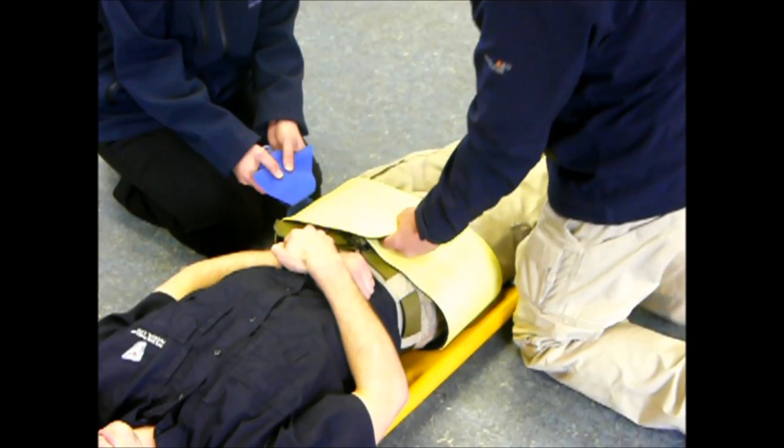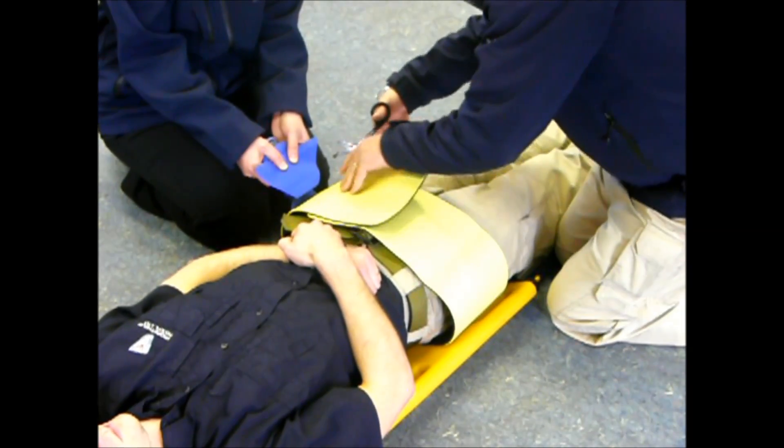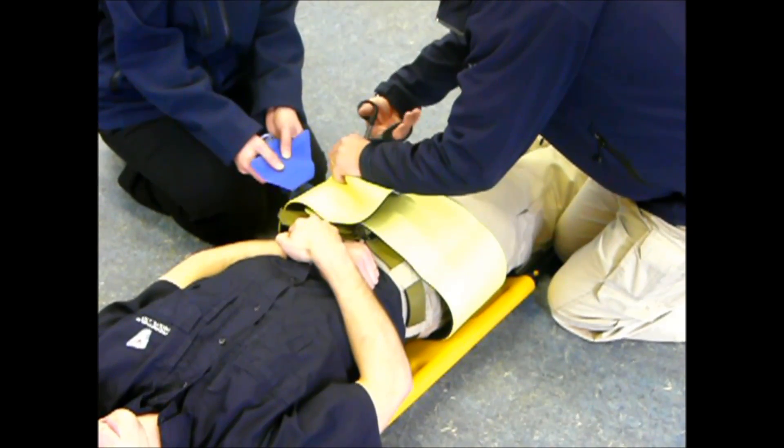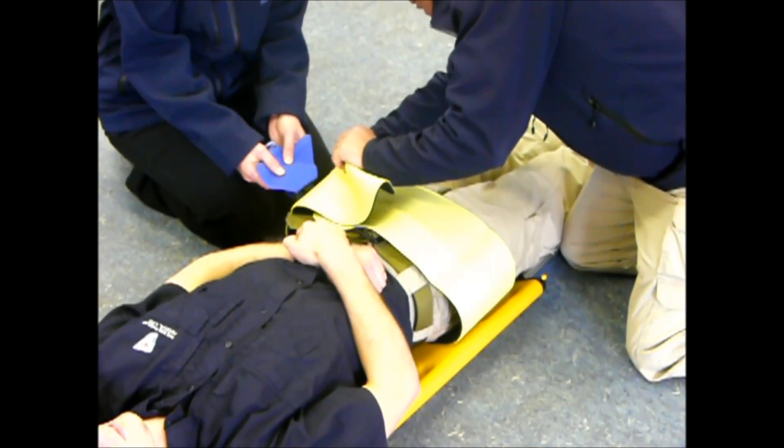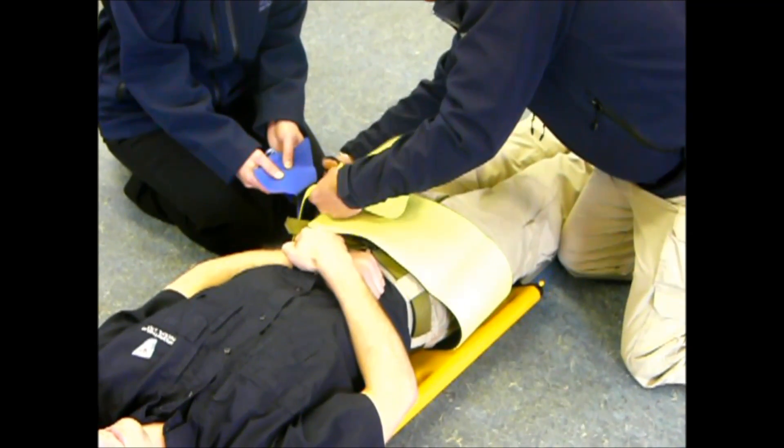Now I can trim this yellow belt to the patient's size. By trimming the belt you'll have access to the groin area. I trim that yellow belt now, making sure I don't cut through the blue strap.